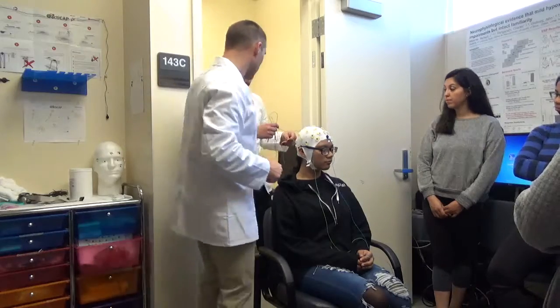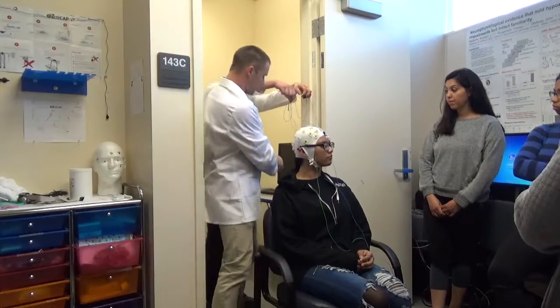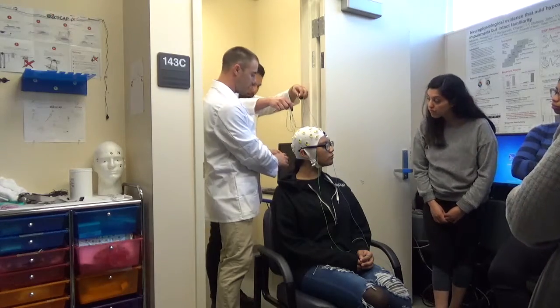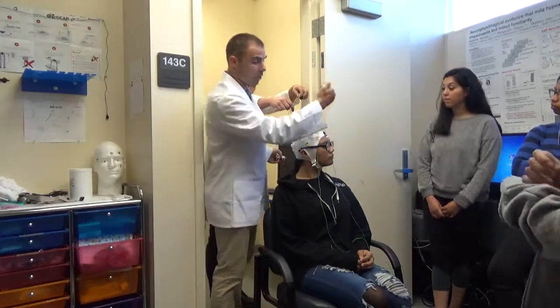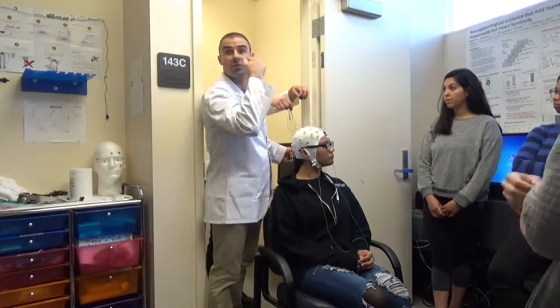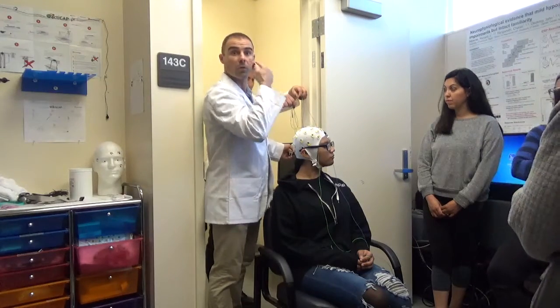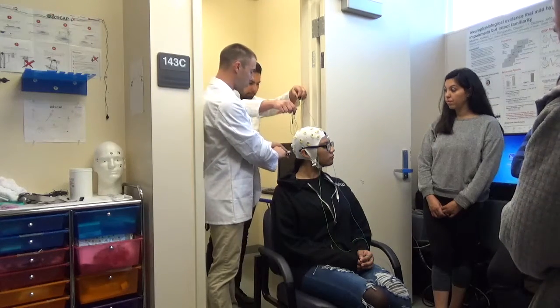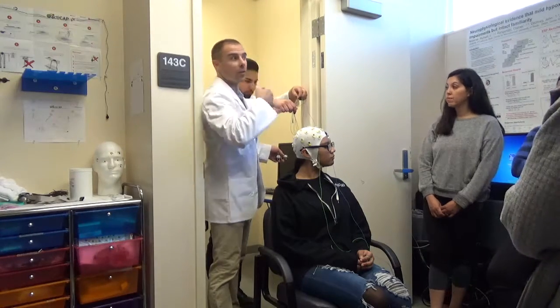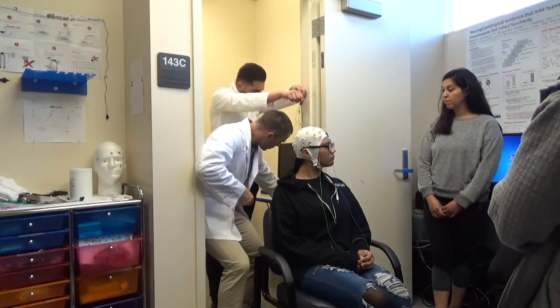And then what these do, let me back up just a little bit. These plug in to these connections here. And they're each labeled for the VEOG, which means vertical electrooculogram. So vertical means this one and this one. And there's a U and an L, so upper and lower. So you connect those as that. And there's another one for HEOG, horizontal electrooculogram. And they're on little Velcro tabs, and we just kind of connect them.